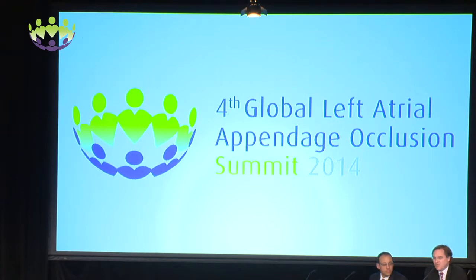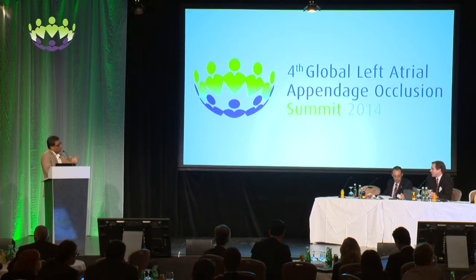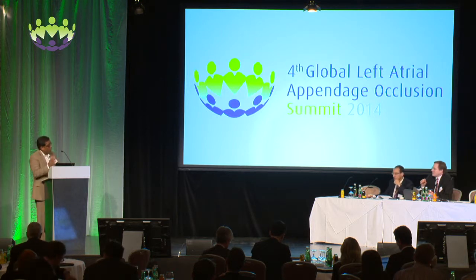One point is you said there is volume reduction of the left atrial volume, but isn't it even more, because due to the trabeculation, the surface is even larger in relation to volume? So maybe excluding the left atrial appendage takes away much more electrically active surface than even volume. Very, very true. I think if you really equate the volume to surface area, the reductions in surface area are probably a lot more than the volume itself. And clearly, the amount of atrial tissue that is available for perpetuation of the fibrillatory waves would be a lot less when you exclude the appendage electrically from the rest of the atrium.